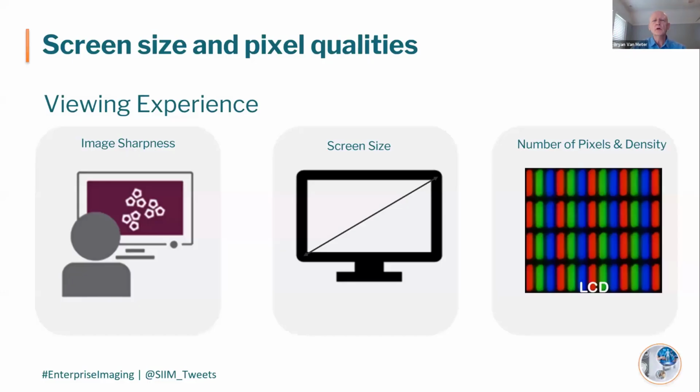When you go to make a decision related to display, what's going to happen is you're going to get hit with a lot of specifications. The thing is that specifications sometimes are okay in isolation, but often they're used in harmony in how they apply. And so one of the things that first happens is, what is the screen size, the diagonal measurement across the screen surface, and then resolution gets mentioned. Resolution is the number of pixels, but those two things appear to be independent.